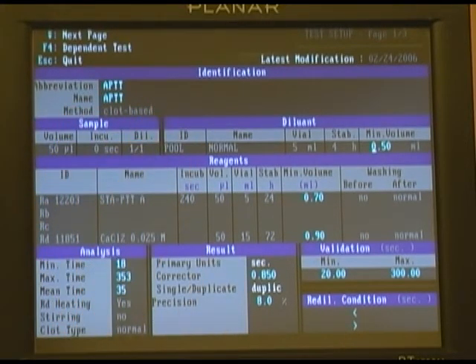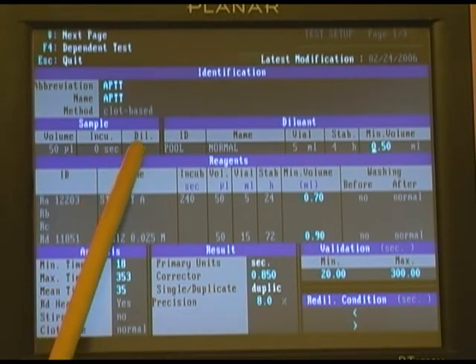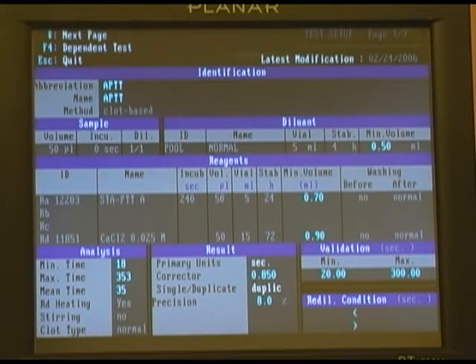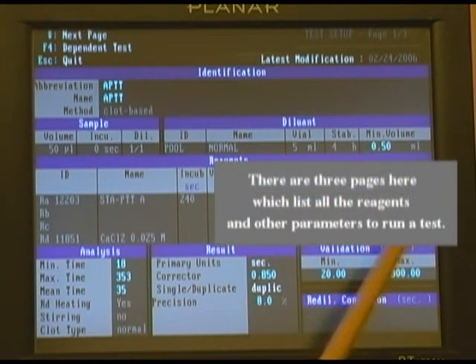Our sample size, incubation time, and dilution factor are listed. Our diluent used to perform the test is also listed.